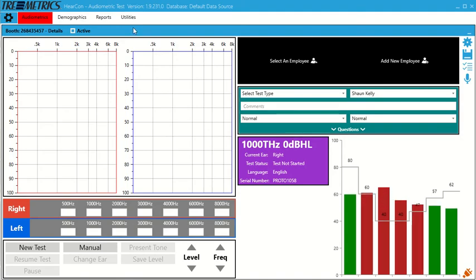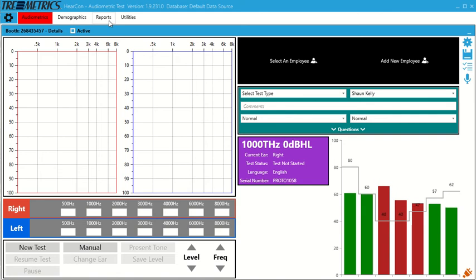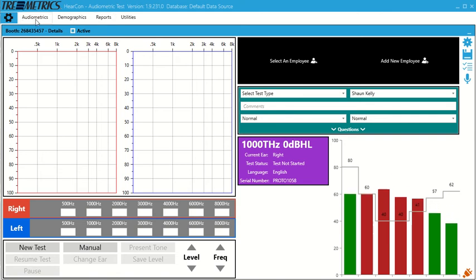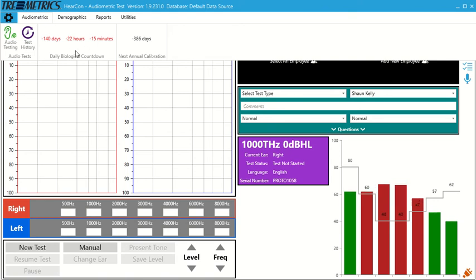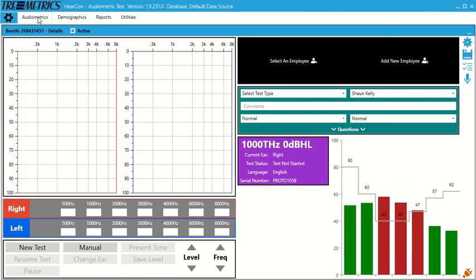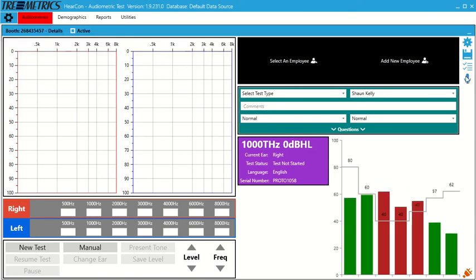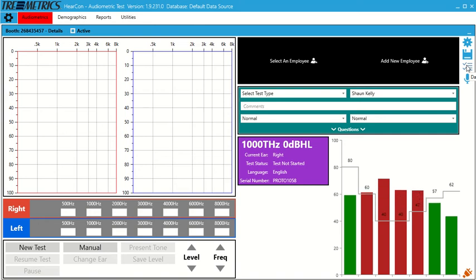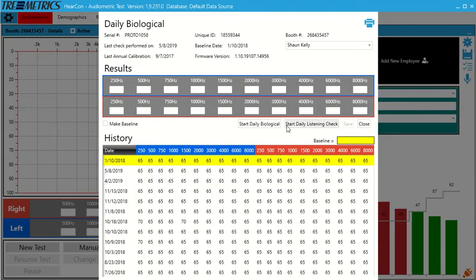So this is the HearCon software. This software is included with the audiometer. If we look at audiometrics here, we see it's color red. If we click on it, you can see there's a countdown for your daily biological. So we can go over here, daily checks, start daily biological.